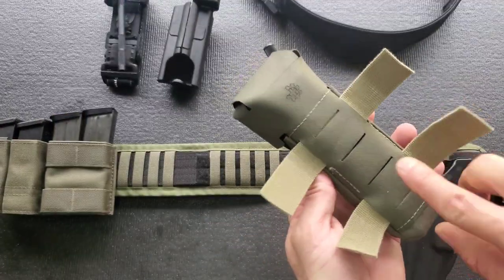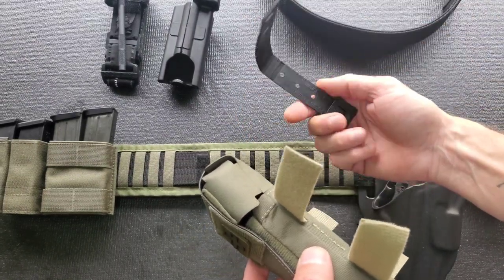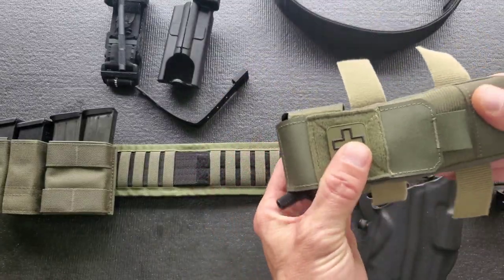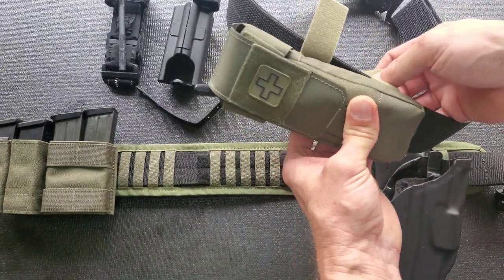This has laser cut slots on the back. It comes with two strips of velcro as well as a malice clip. For horizontal mounting you're going to use the velcro strips, and I have my two inch Uncle Mike's belt here for demo purposes.